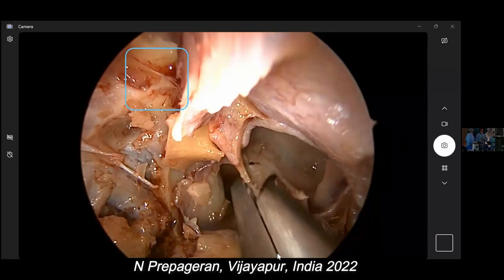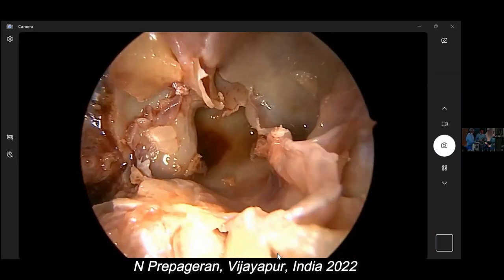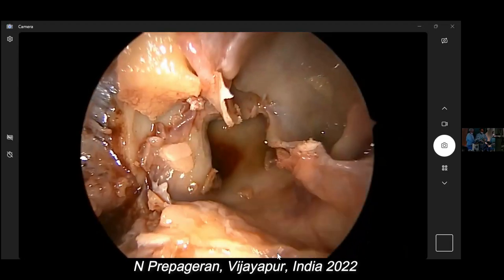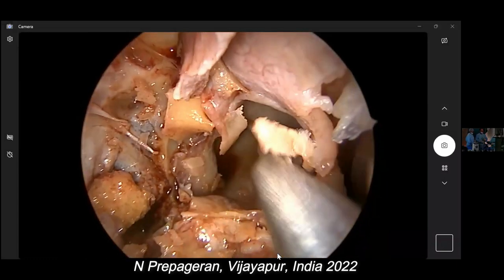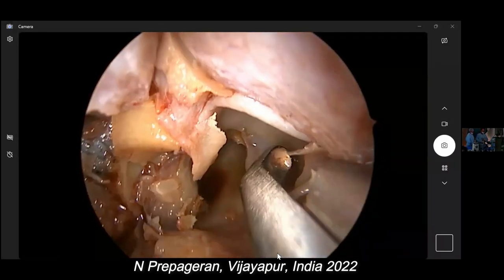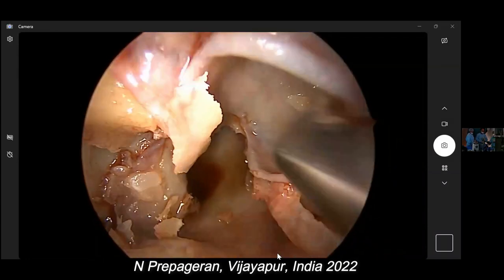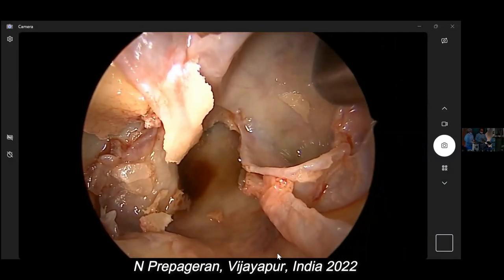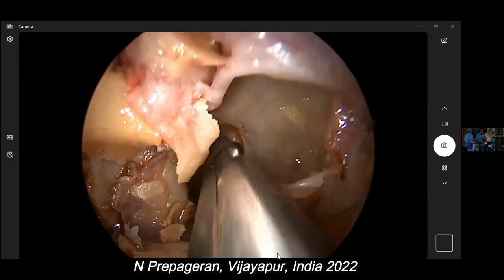So this can be quite confusing, thinking that you're in the sphenoid sinus. Actually, you're not. Can you see? Because the sphenoid is at the back. It's a large air cell that is coming all the way to the ethmoids. See? A sphenoid will show you the OCR. You can't see an OCR, so the OCR is behind this. You understand, right? This is very interesting.